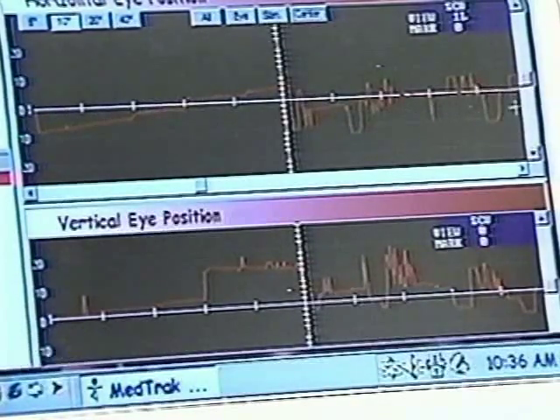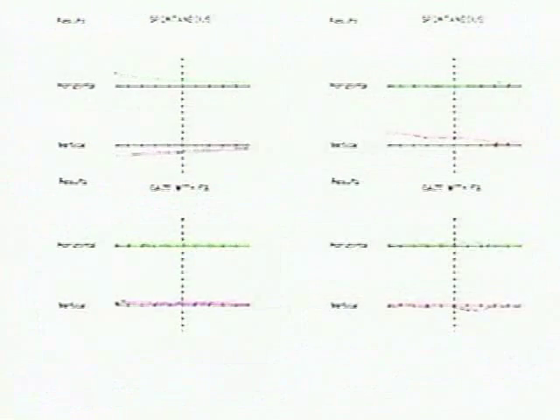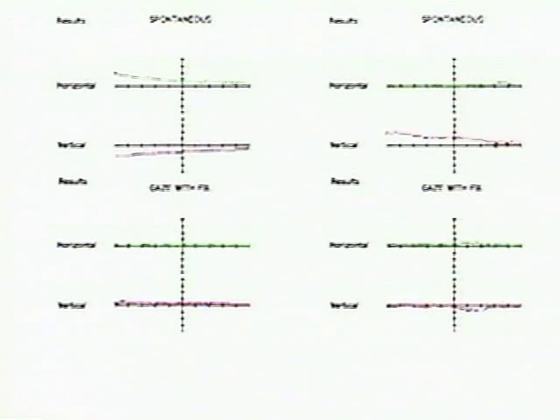It is of paramount importance to coach the patient, to let them know that they must look straight ahead and pay attention to what they're doing at all times in order to avoid some of this kind of phenomenon. It should, however, be noted that in the case of pure vertical nystagmus, this is always indicative of a central nervous system vestibulopathy.